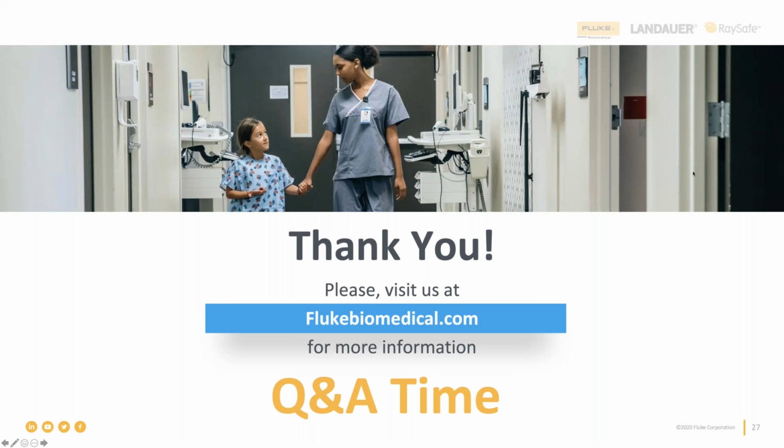The next question is, oh gosh, there's so many. All right, so the next one is, why do we need to test all those ECG forms? Yes, I'll take that one. The ECG form, what you're trying to do with a patient monitor at the end of the day is make sure that it is ready for another patient, whatever patient that might be, to be hooked up.